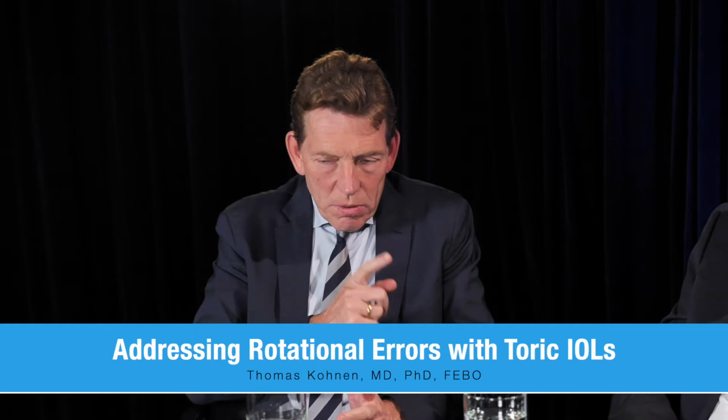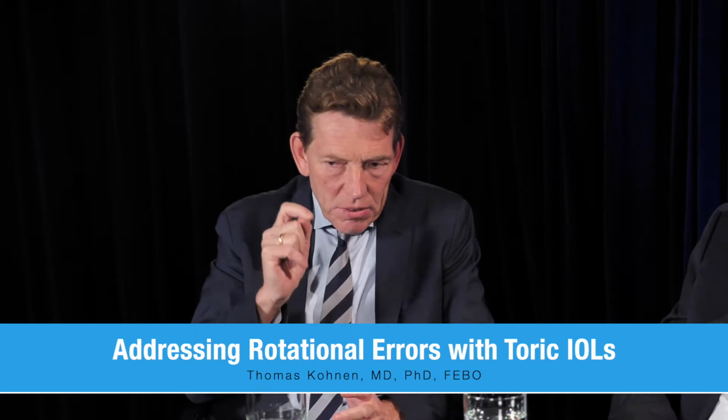Okay. All right. Thomas, I think you have a special way to deal with this, don't you? Yeah. First of all, Doug alluded to this already: you need to take out the viscoelastic substance behind the IOL. You need to make sure that everything is gone. That's my opinion. Is there anybody who would leave it behind? Sometimes I see this. I think it's important.